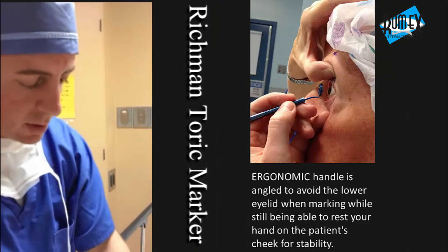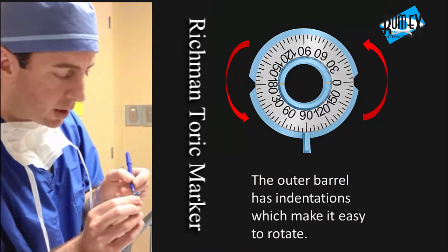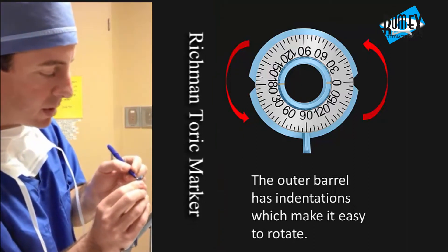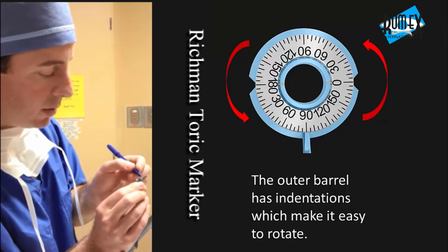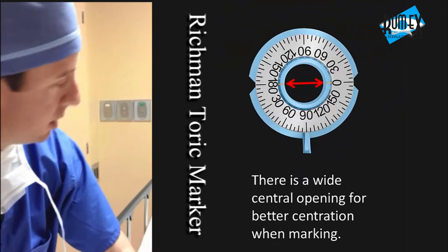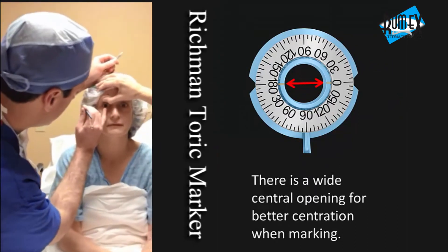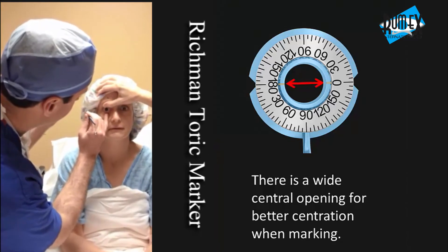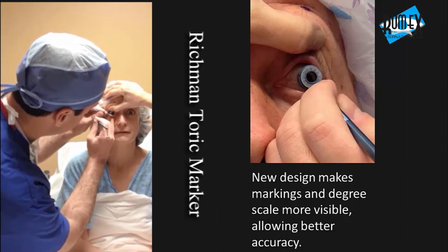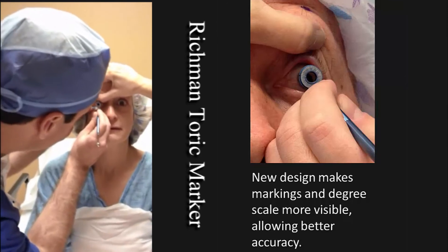On this one, we've already set it up to mark at the 90-degree axis. I put a little bit of ink on the marker. Kathy, if you can hold the upper eyelid please — and your job is to look straight. With the patient sitting upright, chin straight, looking straight ahead. I like to dry off with a Q-tip so the marks stick a little bit, then just let the weight steady, and once you're steady, mark at 90 degrees.